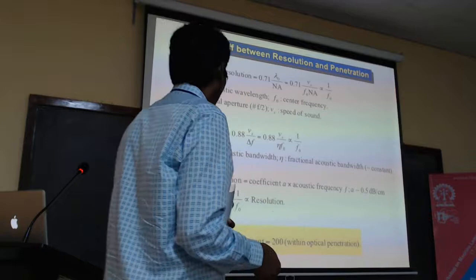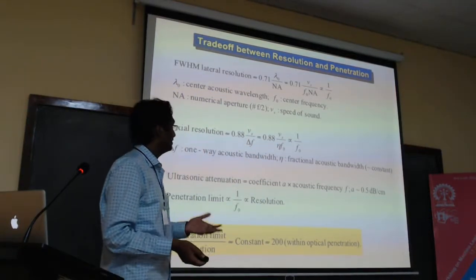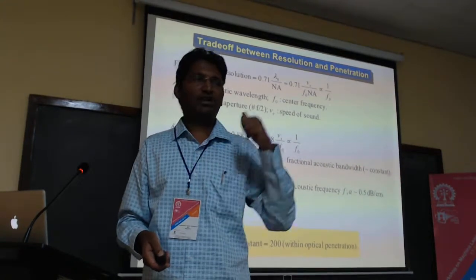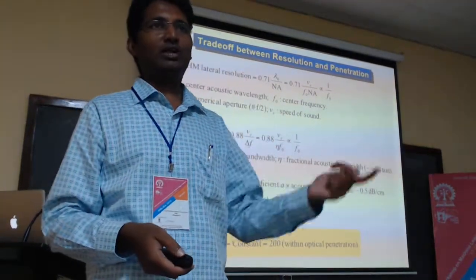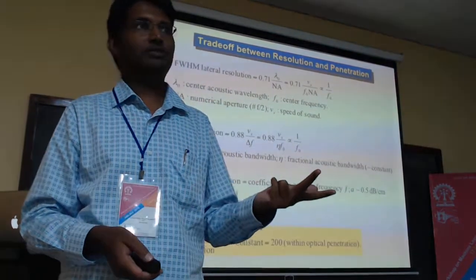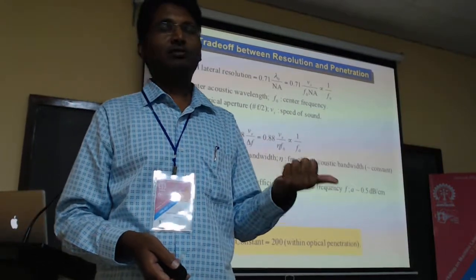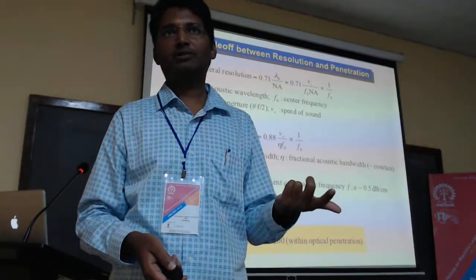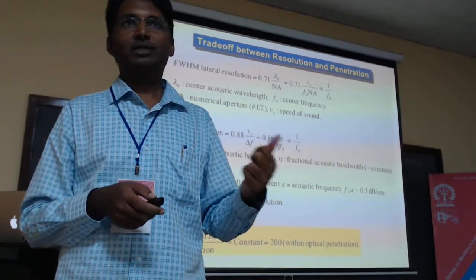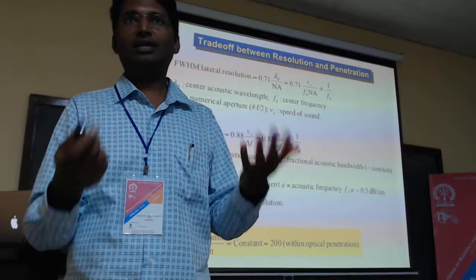Again, there's always a trade-off between resolution and what we call depth of penetration, similar to ultrasound. If you have high frequency, you get very well resolved images, but your depth coverage is going to be very limited. If you have lower frequency, you can cover more depth, but your resolution is going to suffer. Similarly, in the photoacoustic effect, if you want to cover more depth, you have to compromise on the resolution. If you want to cover less depth, you can increase your resolution.